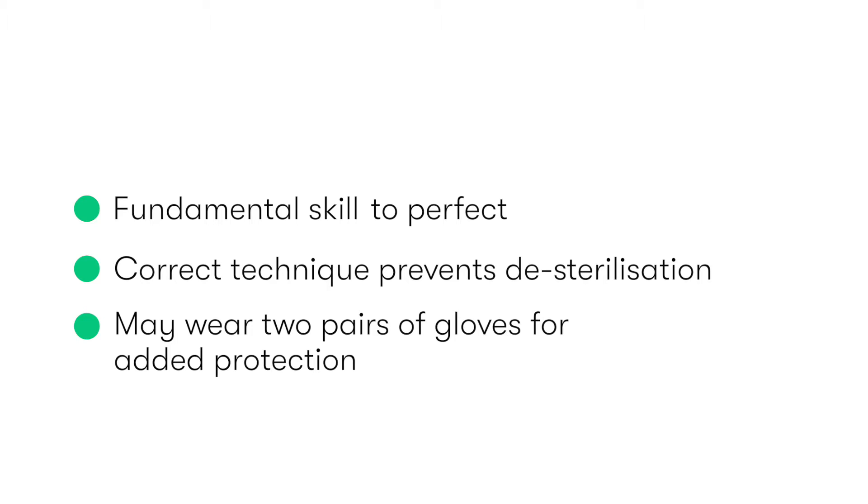However, in this video we shall demonstrate the donning of gloves using the closed glove technique with only one pair of gloves.